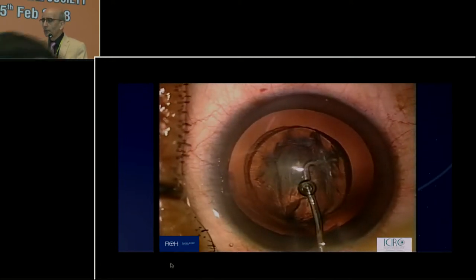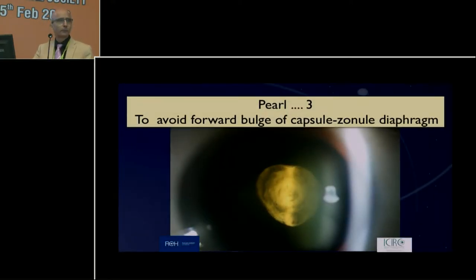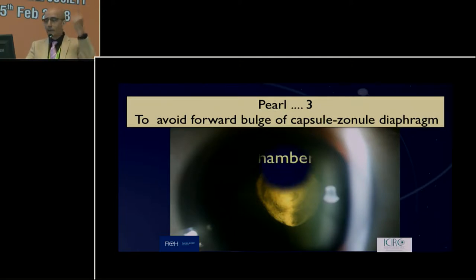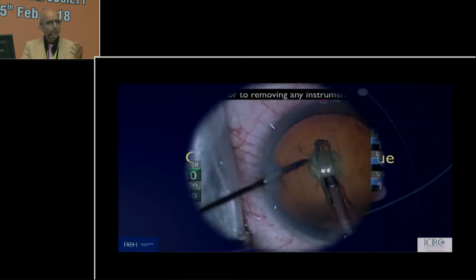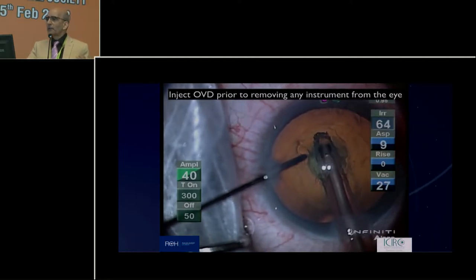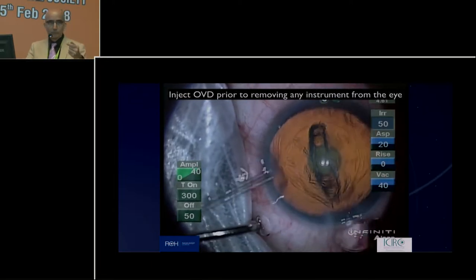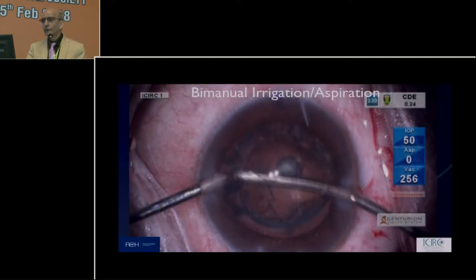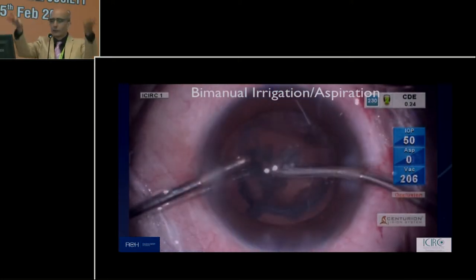This is a typical posterior polar cataract — it's very soft. Third principle: avoid a forward bulge. Adhere to the principles of closed-chamber technique. One key step is to inject OVD prior to exiting — this was taught by Dr. Osher. When making an incision, make a small paracentesis entry, inject OVD, then make the main port so there is no forward bulge. Also use bimanual vitrectomy and bimanual irrigation-aspiration as needed, using the POPs technique: positioning the aspiration port under the anterior capsule, occluding the cortex, and displacing it posteriorly before swiping.